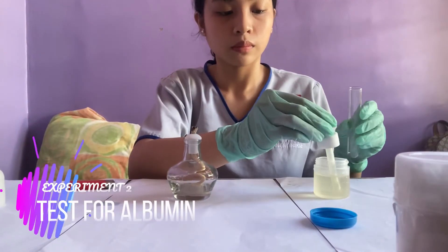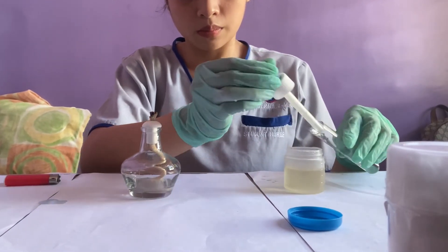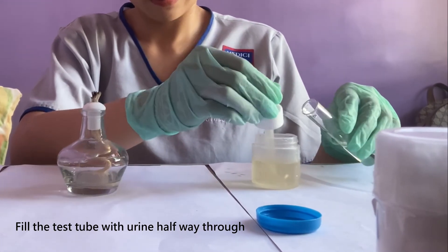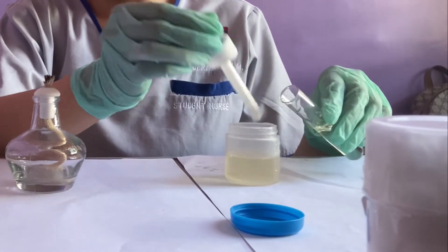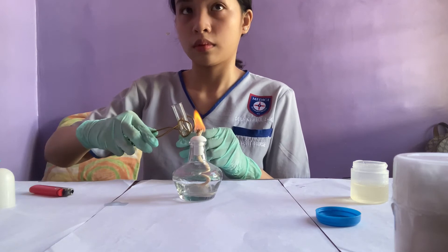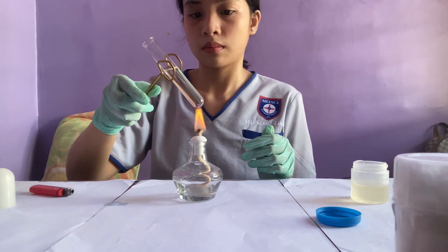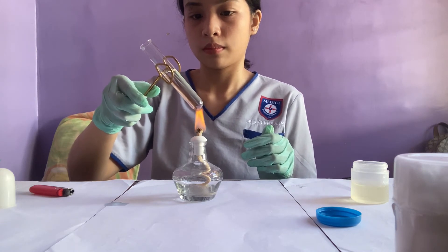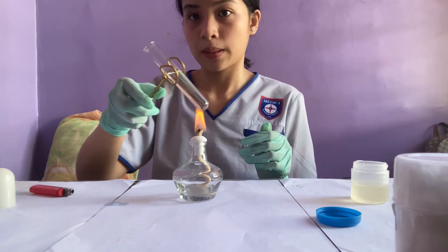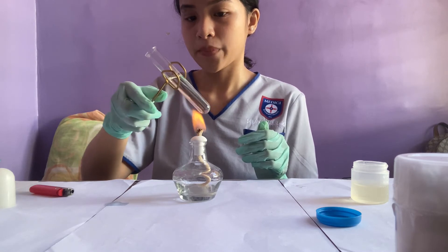This is the second experiment. We're going to fill the test tube halfway with our own urine. Remember that the presence of protein in the urine is not normal — it may indicate a problem with your kidneys. If the result is cloudy, it may indicate protein; if the cloudiness disappears, it may indicate phosphate, which is fairly normal in minimal amounts.